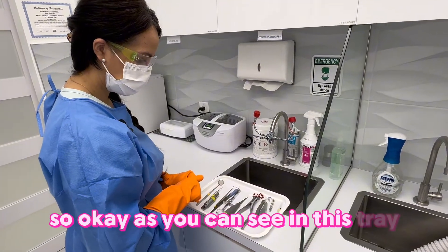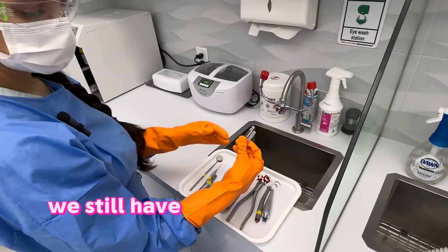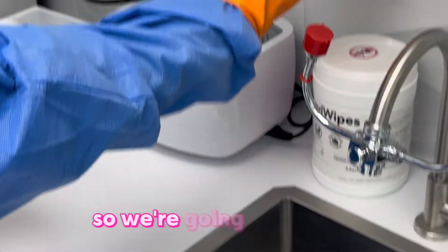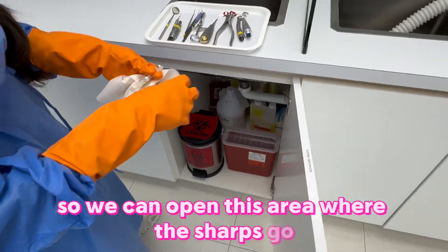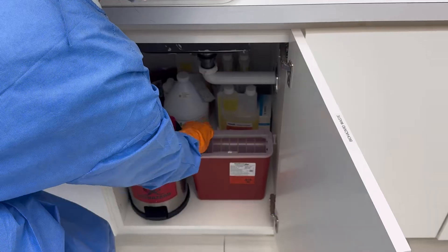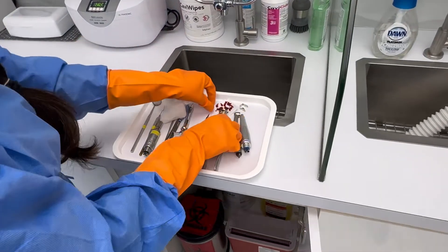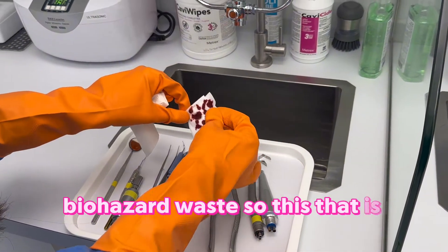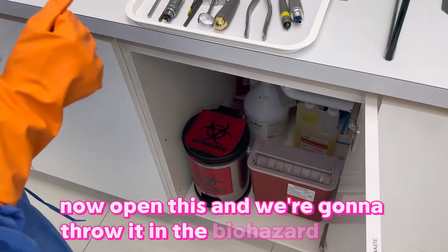As you can see in this tray we still have things that go in the sharps, so we're going to open this area where the sharps go and we're going to throw these in there. Now here we have biohazard waste — this is damp with blood — so we're going to open this and throw it in the biohazard waste.